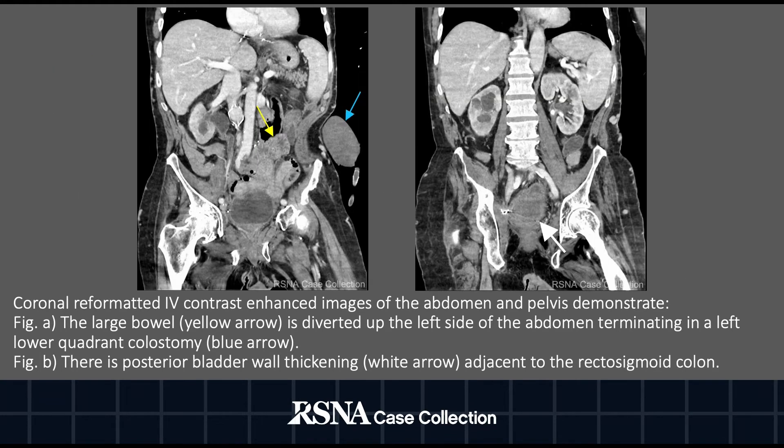A contrast-enhanced CT scan was initially obtained in the emergency department. Coronal reformatted images demonstrate the large bowel being diverted up the left side of the abdomen and terminating in a left lower quadrant colostomy as demonstrated by the yellow and blue arrows in figure A.